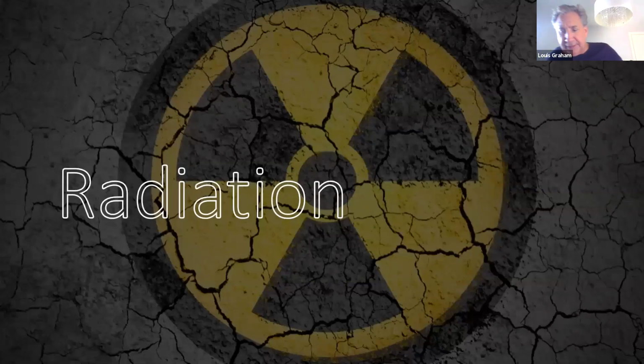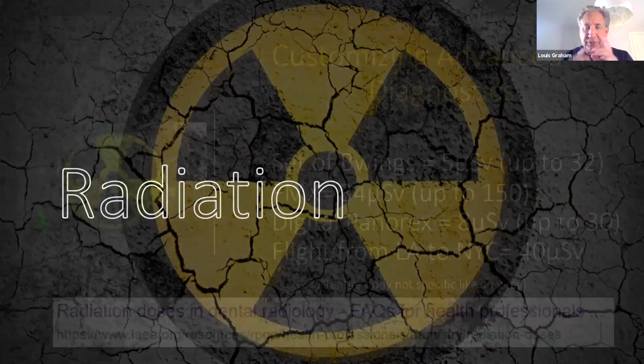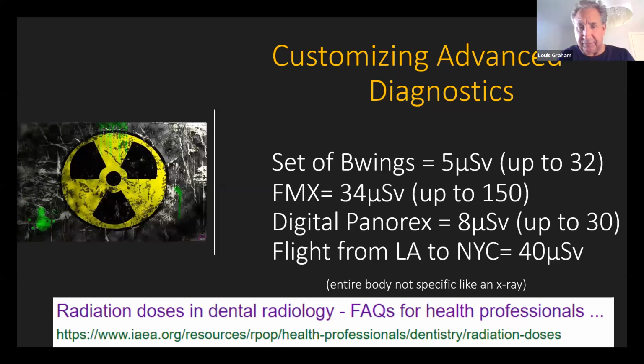So let's talk radiation. Most people think radiation is higher with a cone beam than it is with, let's just say, an FMX. Let me walk you through this. Radiation is measured in microsieverts.